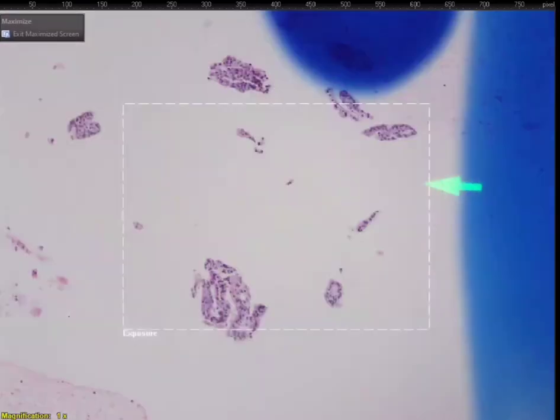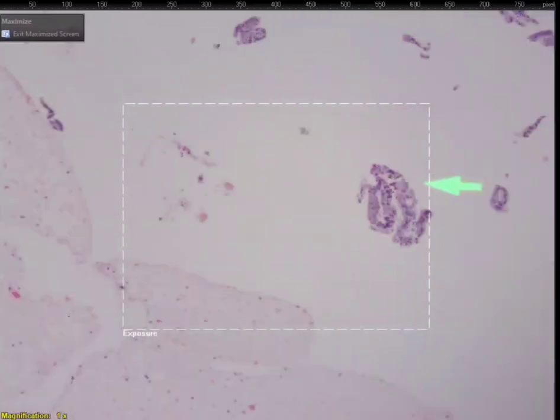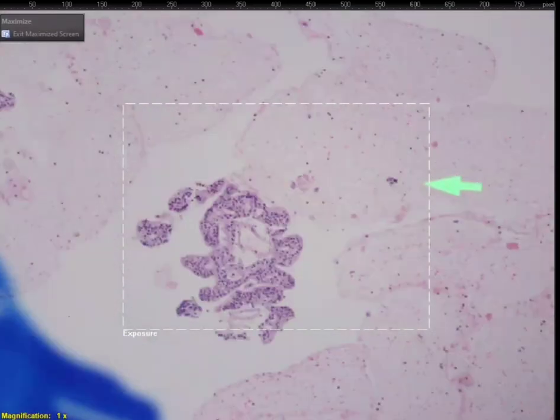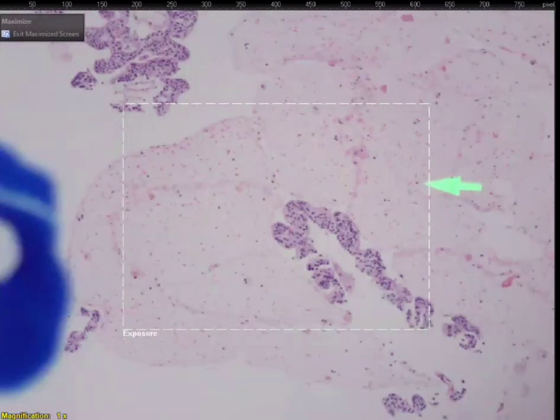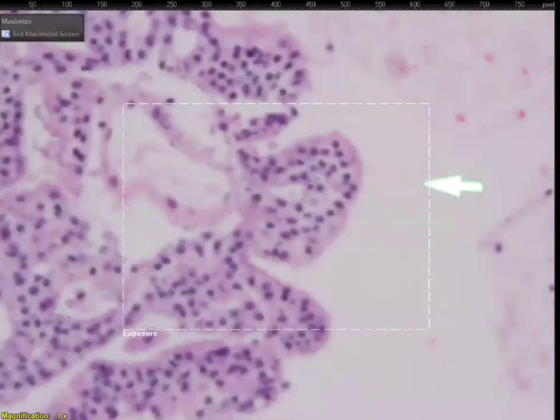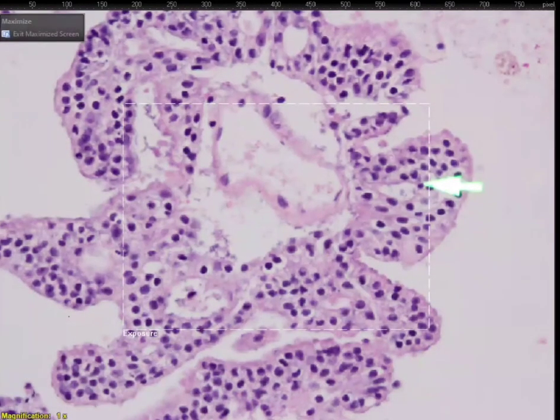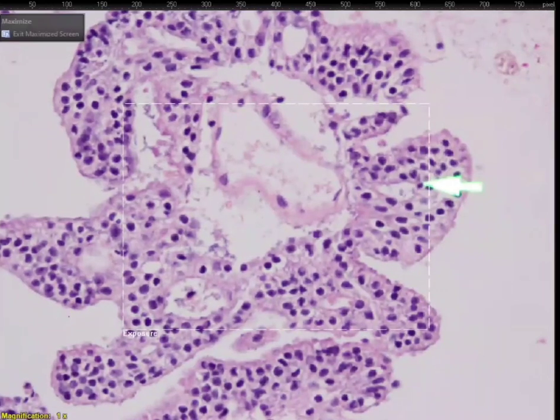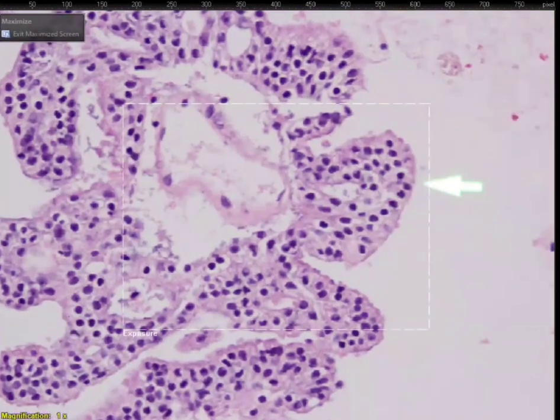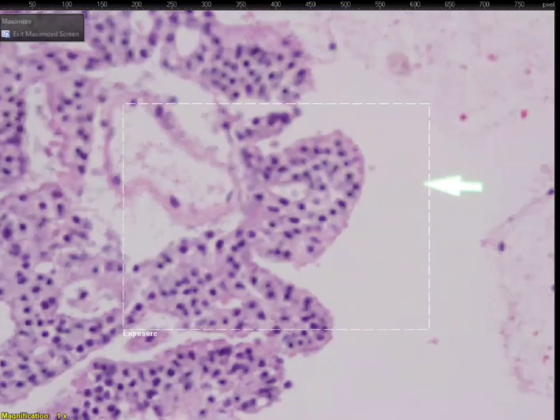Again, little granular gland papillae-like things. Wow, lots. So beautiful block. We can do all kinds of immunos. Not in Afghanistan though. But yeah, anything we see here that is different, or still look the same?